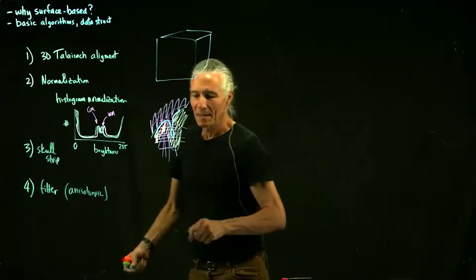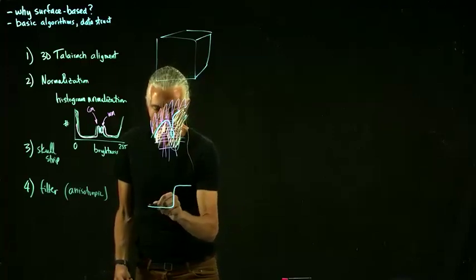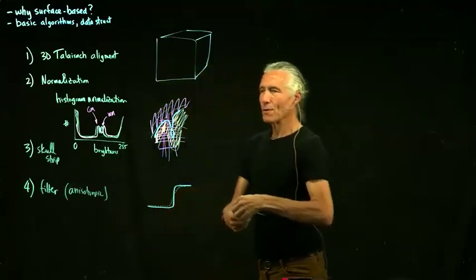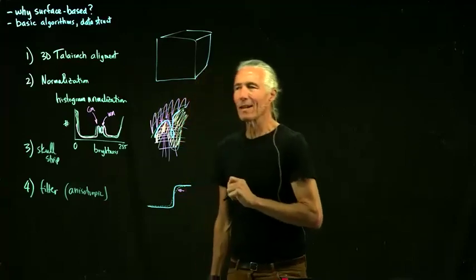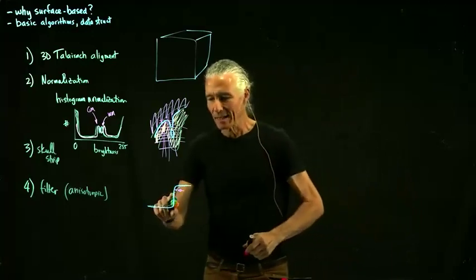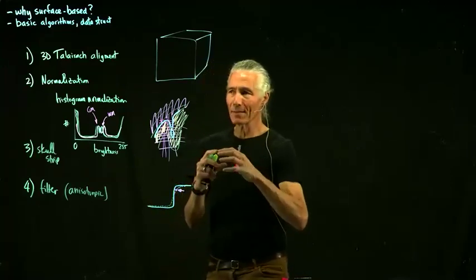In particular, say here's gray matter and here's white matter. What happens when you convolve with a Gaussian? You'll get something that looks like this. It'll blur it out a little bit. And if you're now thresholding, saying this is the level that means I'm in white matter, it will have the effect of actually moving the boundary of the white matter. You could try to select this as the white matter, but then maybe you would get some other junk and accidentally misclassify something as white matter that was actually gray matter. So blurring the data blurs it a lot.